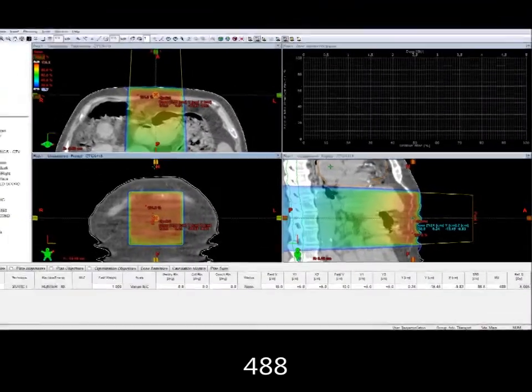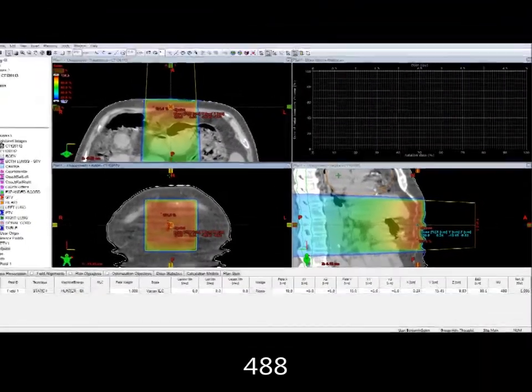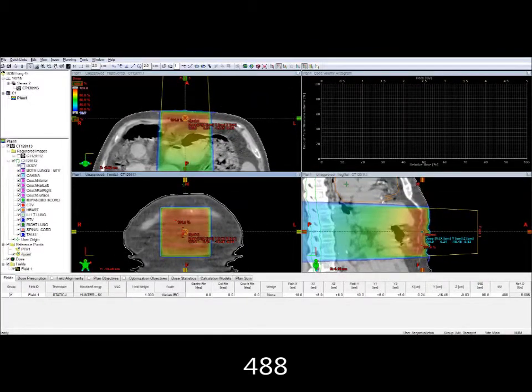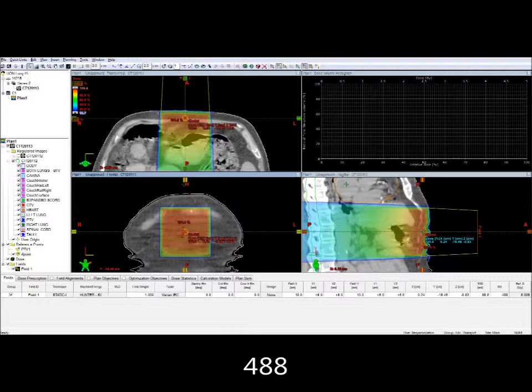Here's what it looks like in the planning system. We've got 488 monitor units, which is extremely close to our manual calculations.